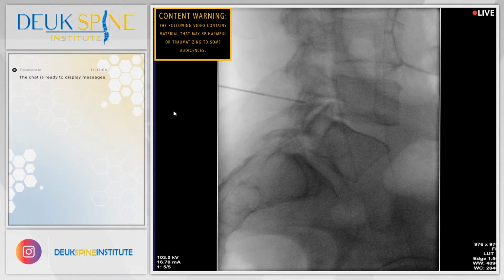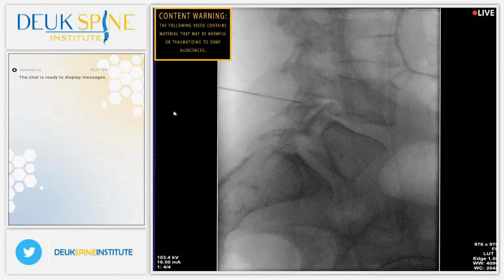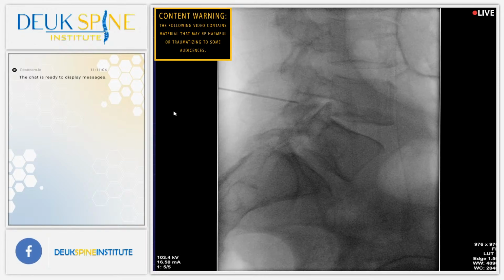That's, I think, a lot better, right? Is it? It's very hard to tell. Keep playing with it, Jordan. See if we can't get it better. If you have questions, feel free to ask. Go a little bit more. Yeah, he just has a really bad scoliosis there. That's quite interesting.